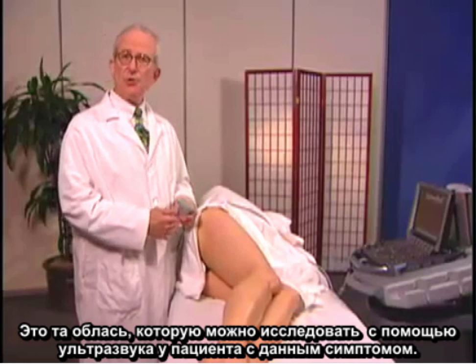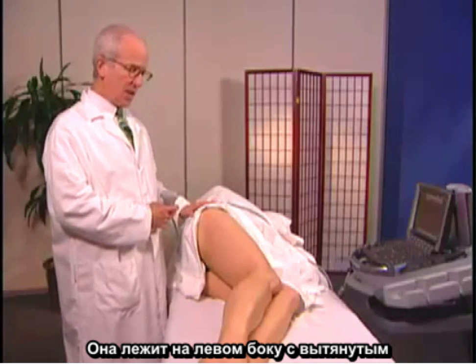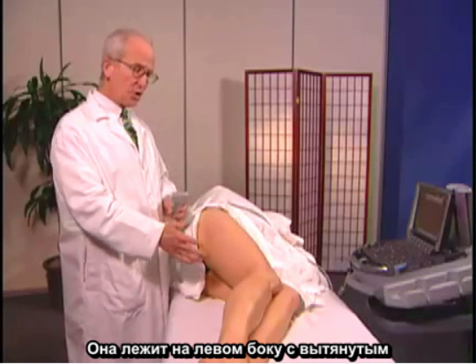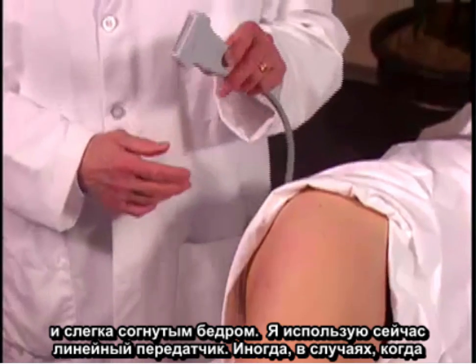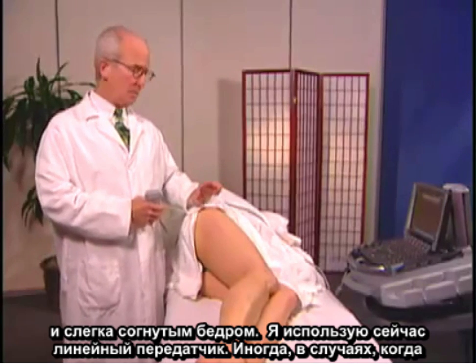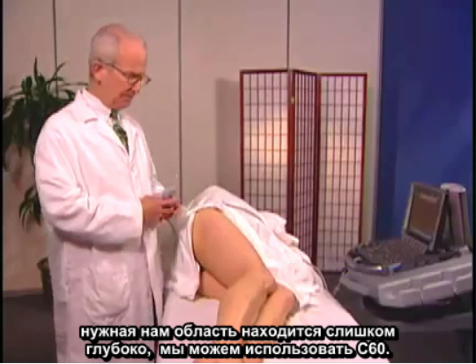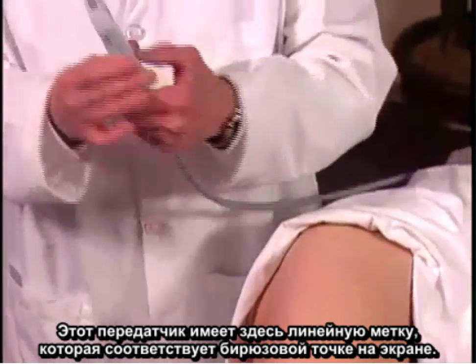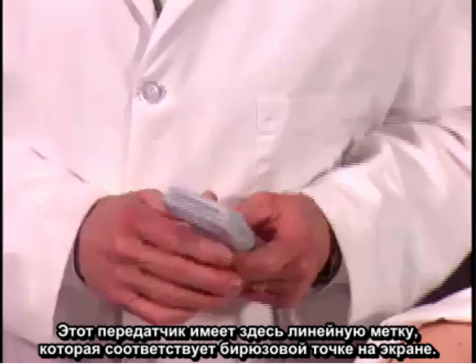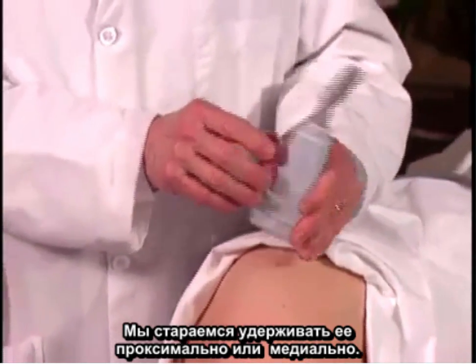This would be an area that you can examine with ultrasound in a symptomatic patient. She's lying on her left side with her hip extended, just slight flexion position. I'm using a linear transducer now. Sometimes in a person who has a much deeper area to traverse, we might use a C60. This transducer has a linear mark here, which corresponds to the turquoise dot on the screen, and we keep that proximal, or we keep that medial.